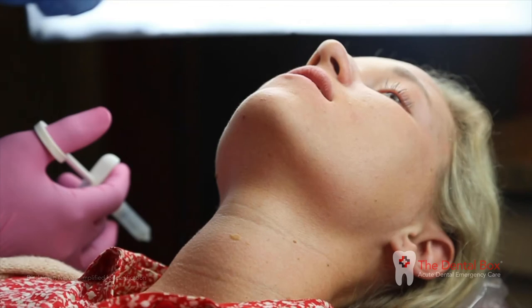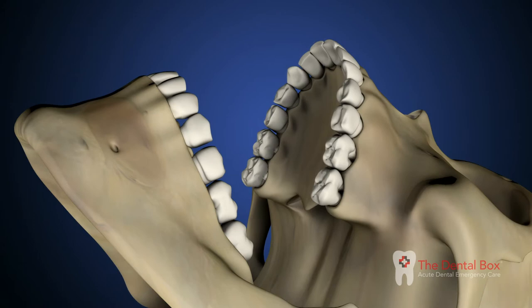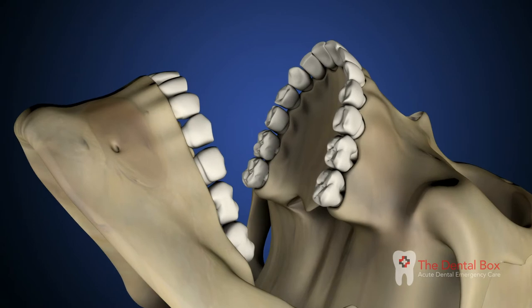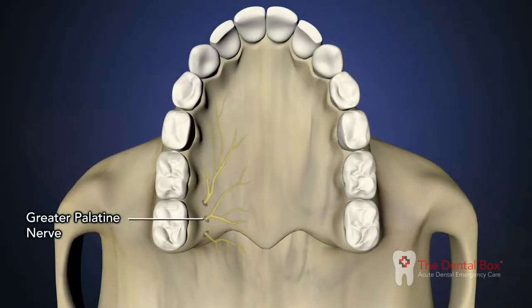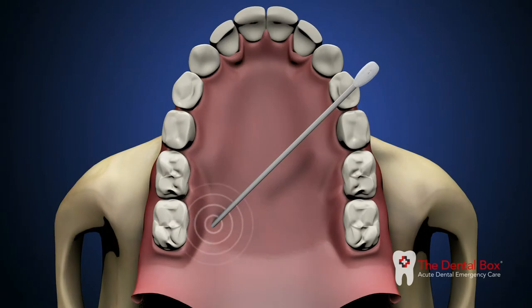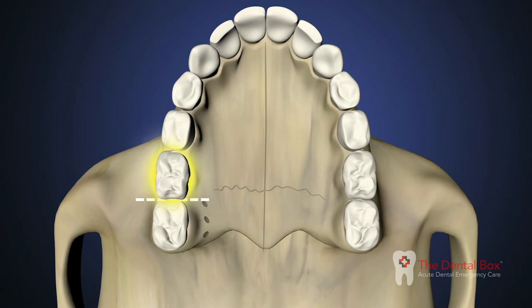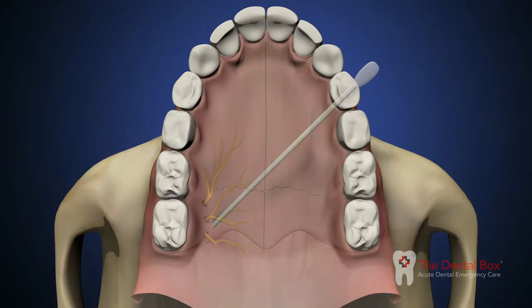Position patient supine if possible. Have the patient open wide and extend their neck with their chin towards the ceiling. Place cotton swab and apply moderate pressure at the greater palatine foramen, which is located just distal of the second maxillary molar where the teeth transition to the roof of the palate.